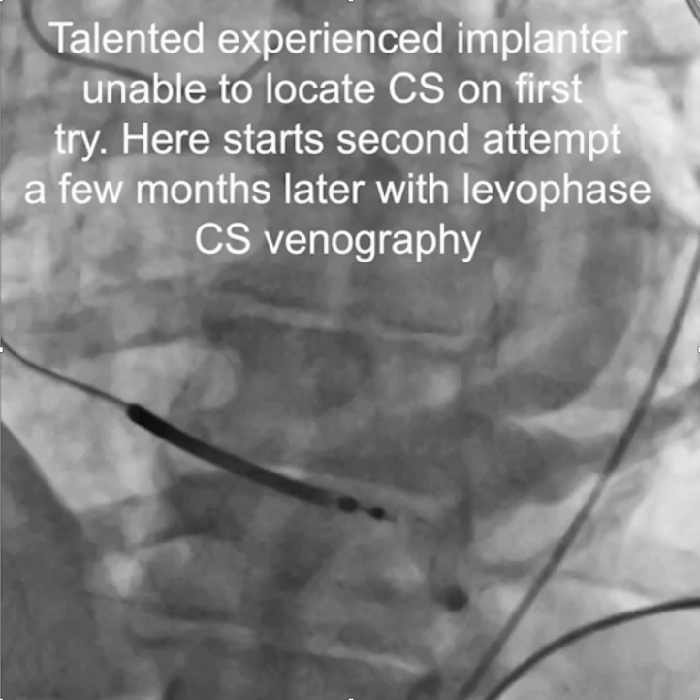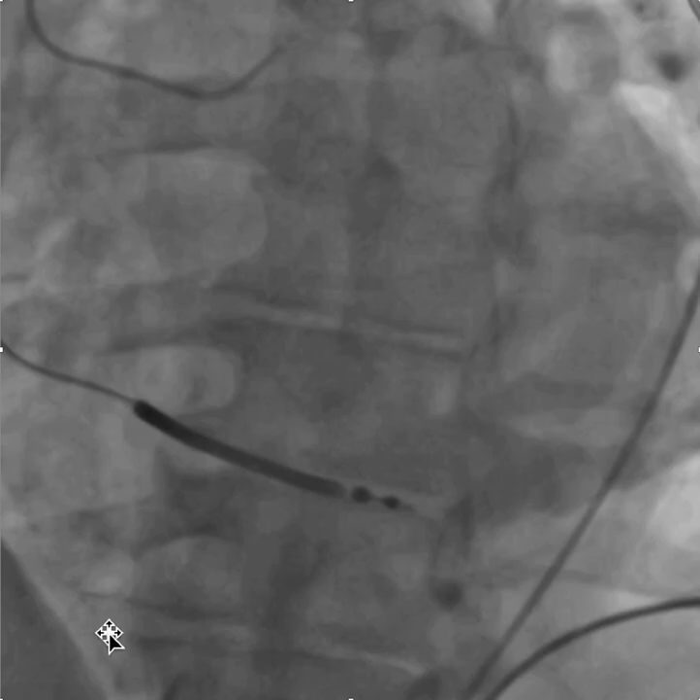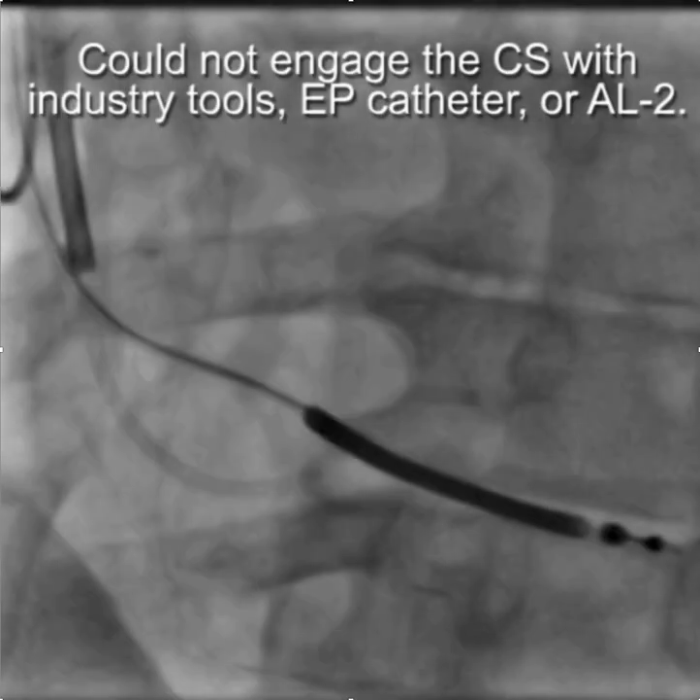This is a case that fairly powerfully demonstrates the value of the Worley LV Lead delivery system. We have a very talented, experienced implanter who was unable to locate the CS on his first try. Here he is doing the second attempt a few months later, and wisely started off with CS phlebography. With this you can see the coronary sinus, and in the LAO projection it's clear that the CS is draining into the right atrium, and thus it is possible to implant once you can find the CS.